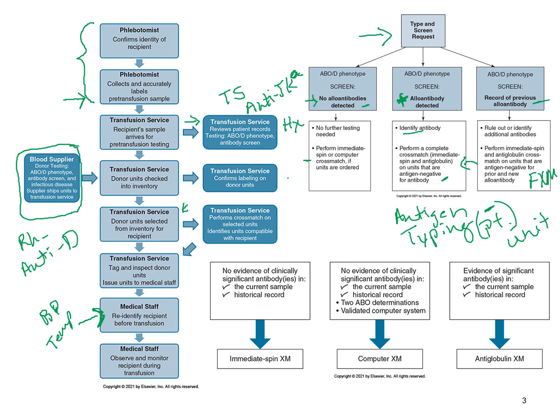So it's within a certain amount of time after they start the transfusion, about 30 minutes in, and then an hour, and every hour after that. I think it's 10 or 15 minutes into the start of that transfusion. And another thing to keep in mind, when they hang these units of blood, it's actually got a line that's running. So once they hang that unit of blood and they open it, it becomes an open system, so they actually puncture into it, and then it usually joins in with some sort of saline as well, a little bag of saline that's hanging up as well.